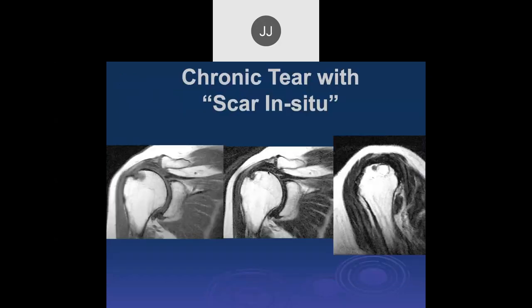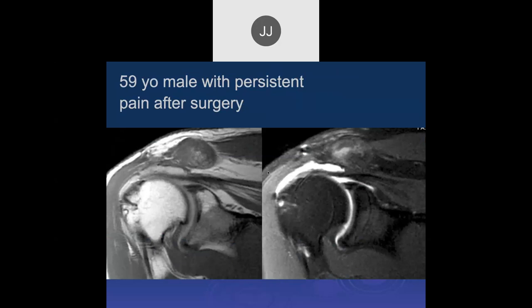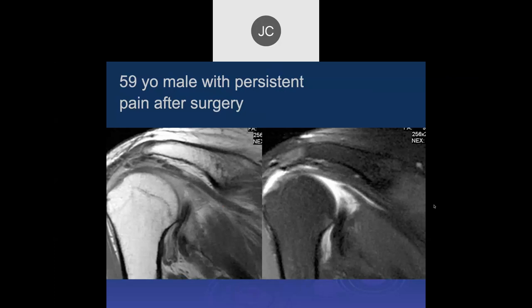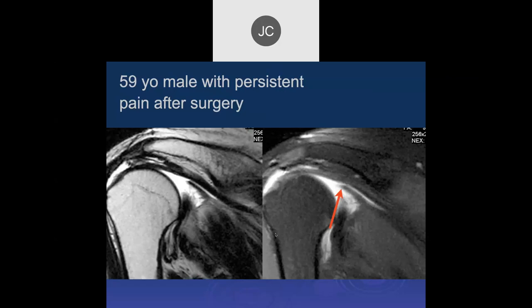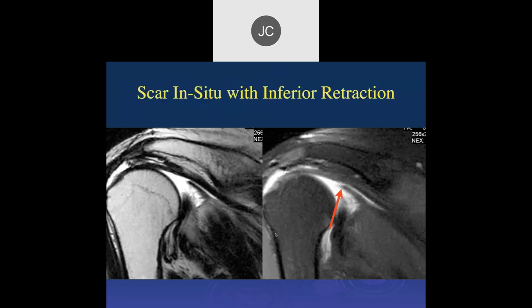A 59-year-old with persistent pain after rotator cuff repair surgery. It looks like the musculotendinous junction has retracted again — concerning for a re-tear with some scar inside. There's an interstitial tear going posteriorly into the infraspinatus tendon, making this a large tear. There's some metal artifact from the prior surgery, and what appears to be scar in situ coming across the repair site.